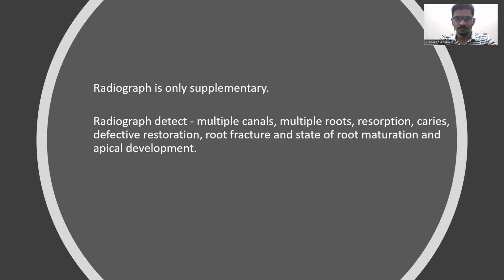Radiograph can be used to detect multiple canals, multiple roots, resorption, caries, defective restoration, root fractures, and state of root maturation and apical development. So we cannot reach a conclusive diagnosis by radiograph alone, but it usually serves as an adjunct to clinical diagnosis.